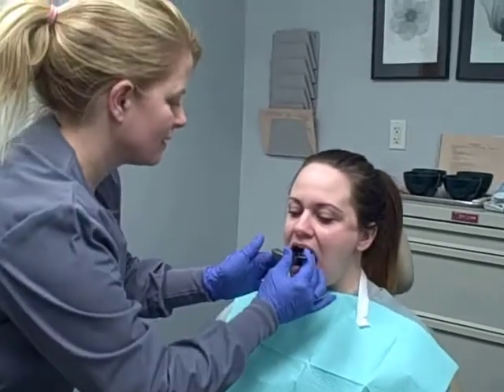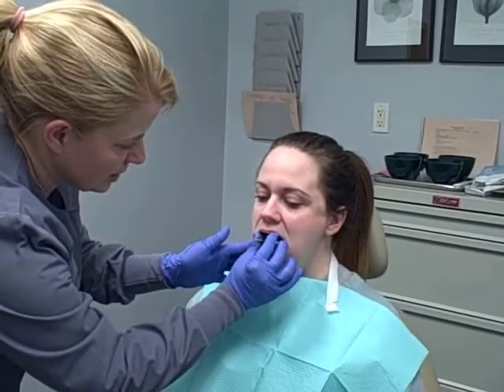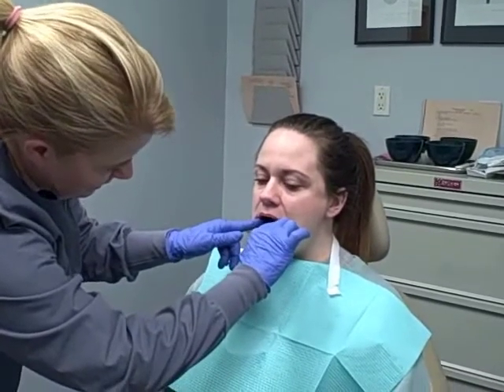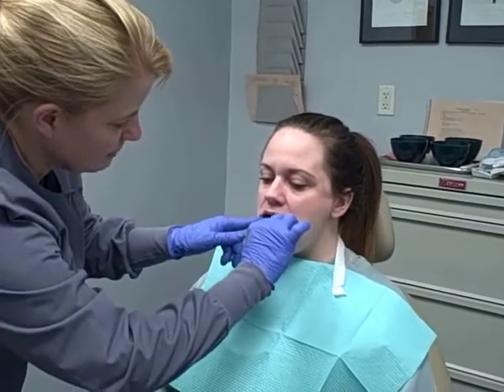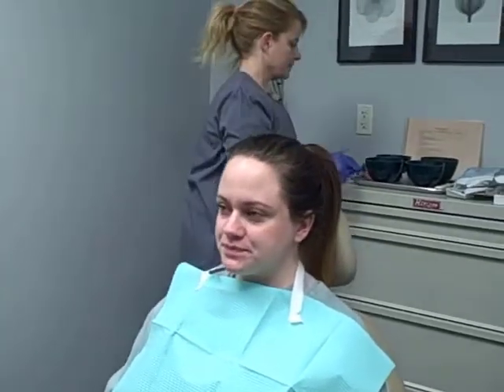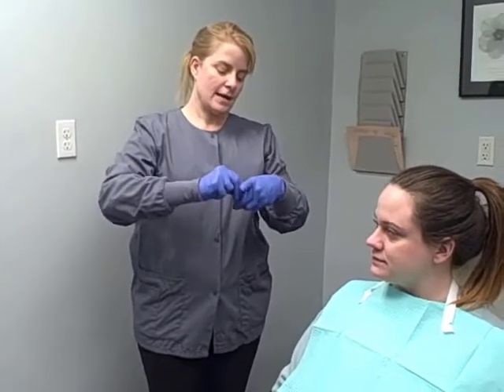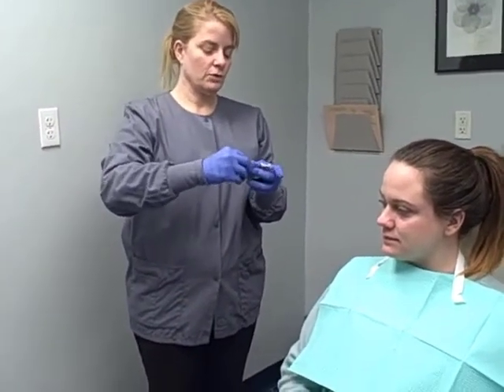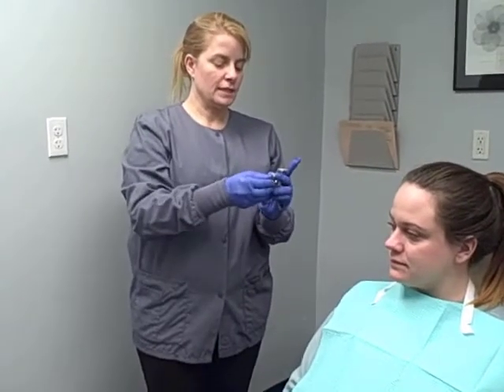Then I have the mandibular tray. We're going to try that in, just gently moving our lips out of the way. Lift your tongue up. And that fits well too — it doesn't bind, it doesn't catch on any teeth. I am putting wax on the back of both of the trays to make it a little more comfortable and give it a little bit of an extension.